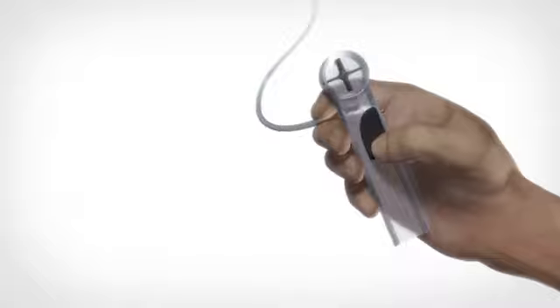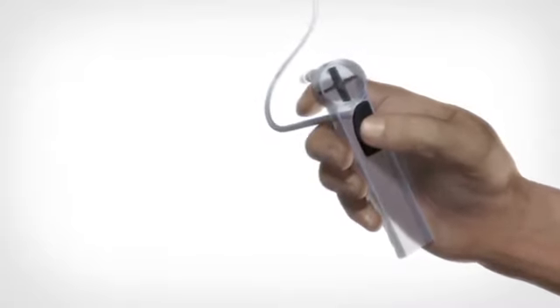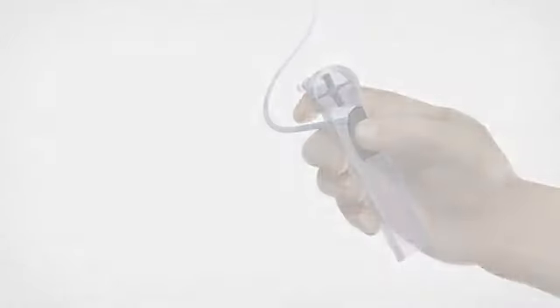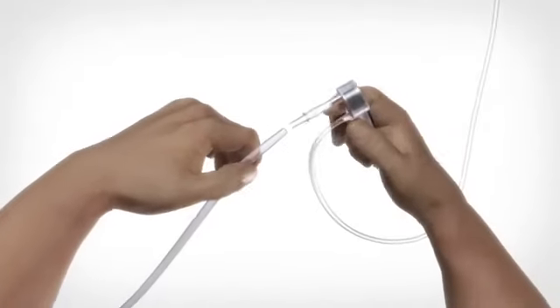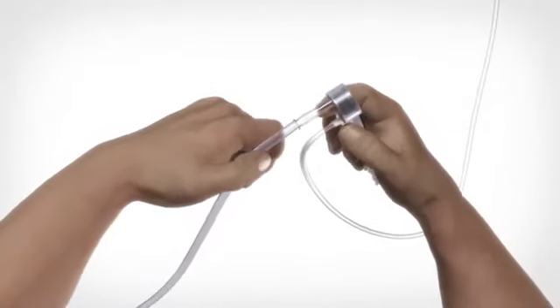Start by making sure that the flow regulator is completely closed. Connect the tube on the cone to the flow regulator.